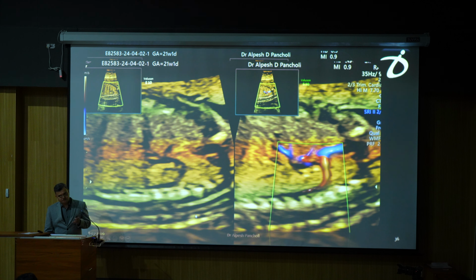In the heart, as I told you earlier, do fetal echo. What you see is the AVSD. Here there is no crux, and in the systole we find linear insertion. So this is an AVSD. This is the still image showing the single AV valve. And always look for whether portal system development is there or not. We don't find any portal branches as we described earlier. So in umbilical systemic shunt, usually there is no portal venous development.